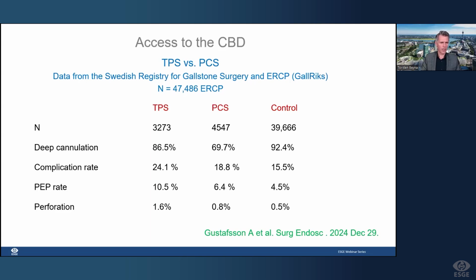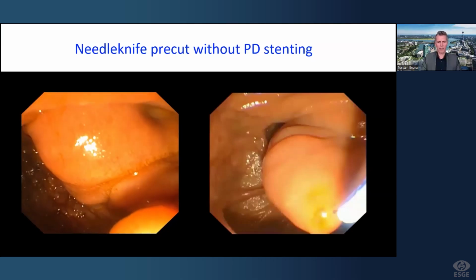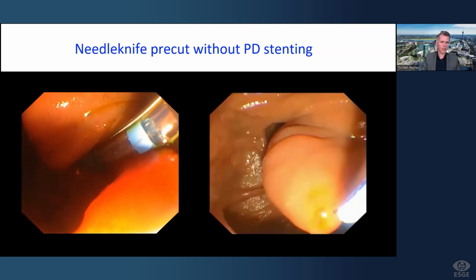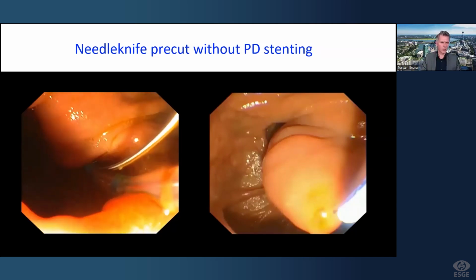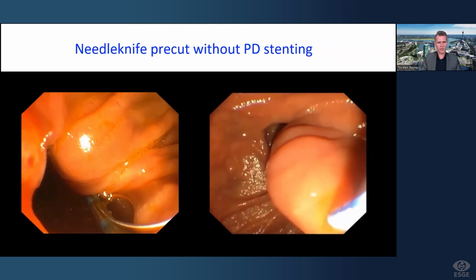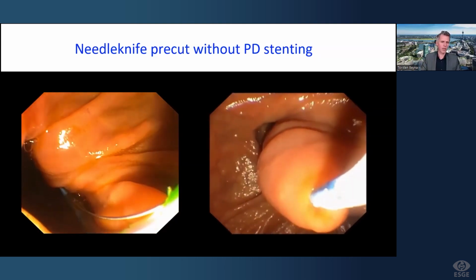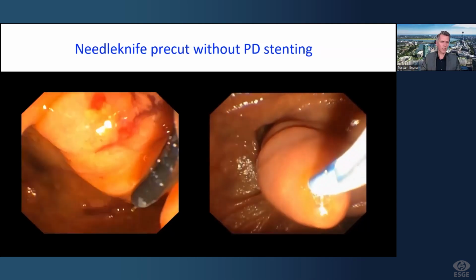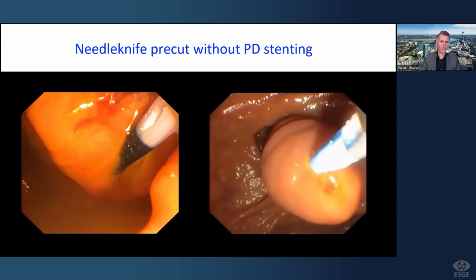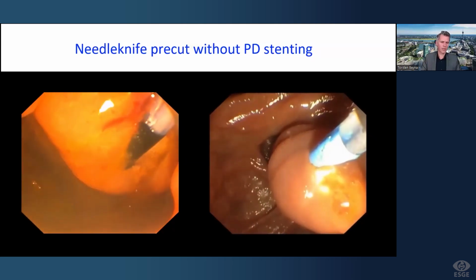So what should we do now? I think we have tailored approaches depending on patients' individual anatomy and if you get into the pancreatic duct or not. For example, here we have been talking about diverticula, so I will start the second video as well. Here, on the left-hand side you see a duodenal diverticulum. The papilla is inside. Even with the sphincterotomy, it was not possible to enter, and at this point, it was necessary to do a needle knife precut here. So always be aware that anatomy is different, so you don't have a thick muscle layer.